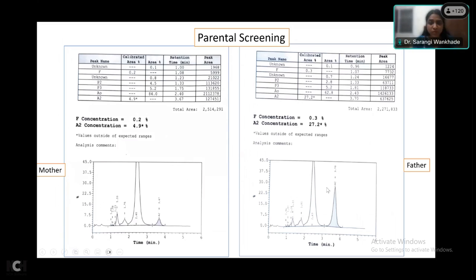A2 is 27.2%. Right. So A2 is 27.2% and इस A2 डिवीजन में हमारे पास क्या क्या एल्यूट होता है? HBE. Yes. Very nice. The mother is basically a beta thalassemia trait and the father is a likely case of HBE. And why not HBD, Diljot? For that, the A2 should be around 40% or so. Right, very good. So अभी मैंने बताया ना because HBE is like a thalassemic hemoglobinopathy. So एक variant बन रही है chain and उसका production भी कम है. तो HBE का heterozygous states में usually it is up to 30%, right?